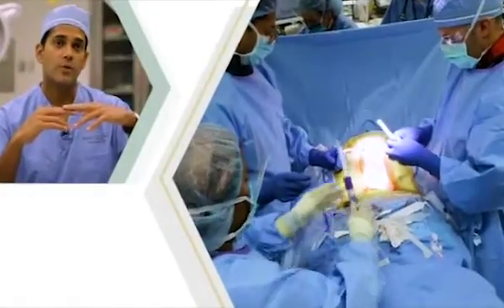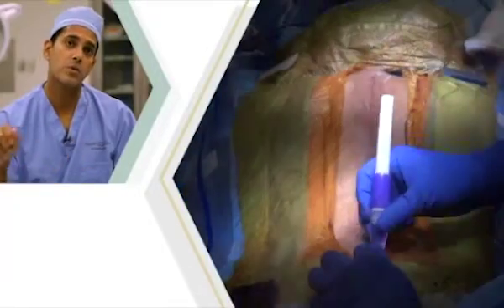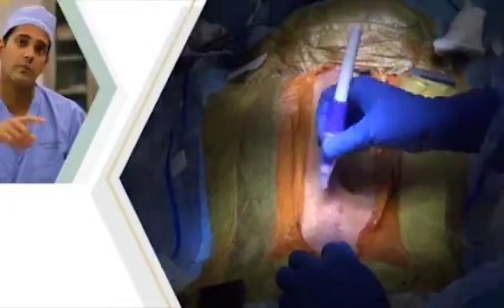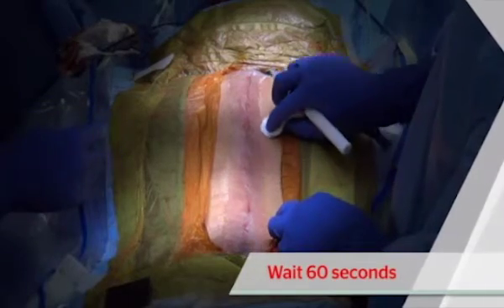Then you can apply the Dermabond liquid. It's very important to apply the liquid in a very thin layer with short strokes covering the entire surface area. After applying the liquid, you have to wait 60 seconds drying time.